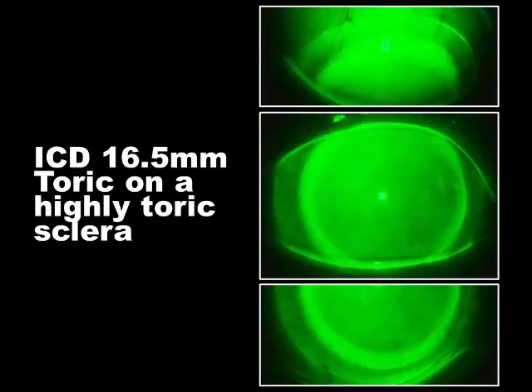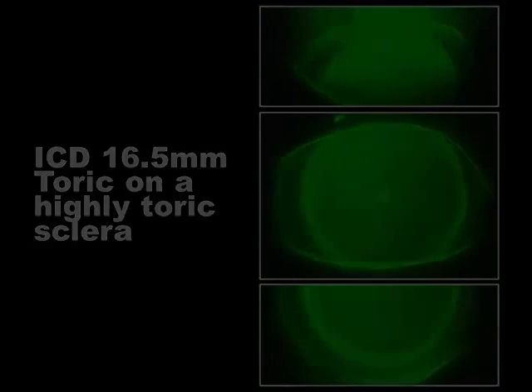And that's what's been constructed. So now you have the ability to make a toric ICD. It has one meridian of depth across the flat and a completely different meridian of depth across the steep. And now you see it actually landing itself down 360 degrees around, which is our goal. Landing at 360 degrees traps that fluid, avoids getting air bubbles in there, and in the ocular surface disease patient, that's what creates the bath that gives the dry eye patient relief from their symptoms.